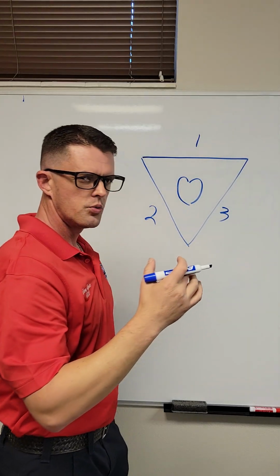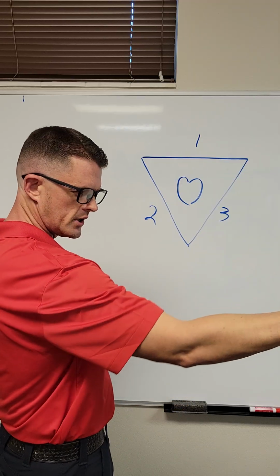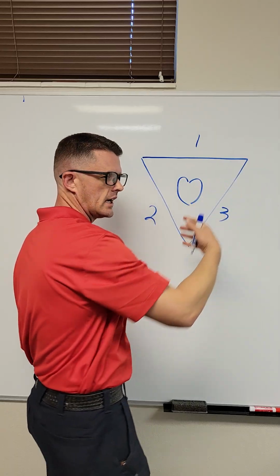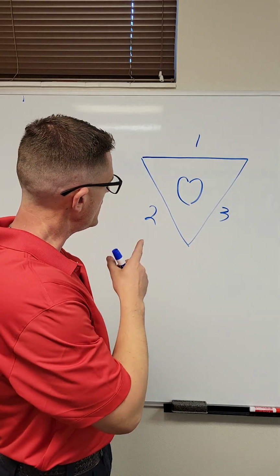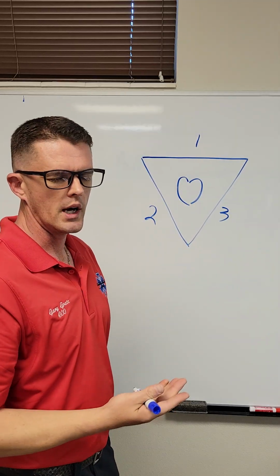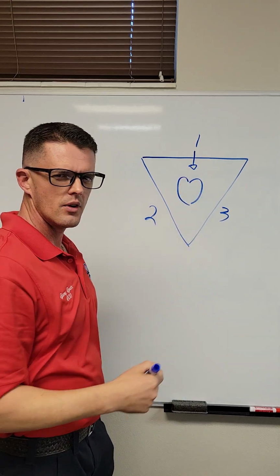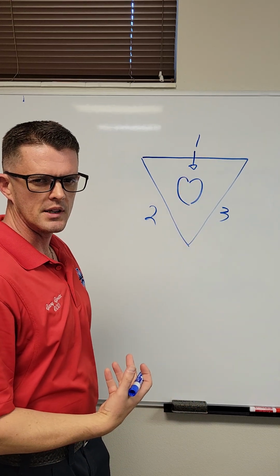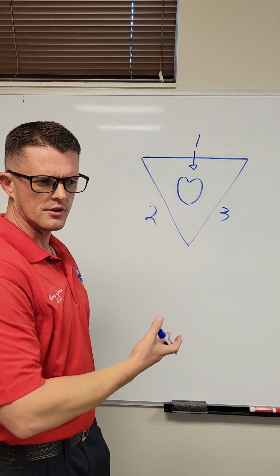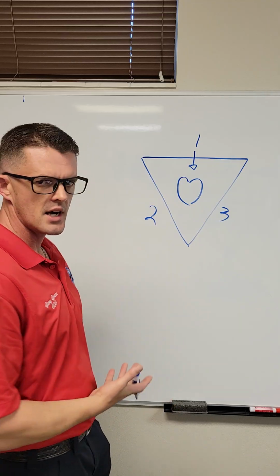One, I know typically is more or less a lateral view. It's usually coming in from the side, right? You've got AVL, 1, V5, V6, and they're looking at it through this lateral view. But a lot of your books will put this diagram up there, and you see 1 on top. And it doesn't make sense. You're like, 1 doesn't look down. It looks in from the side. So why would it be there, right? And 2 and 3, well, those are inferior wall, like 2, 3, AVF, that's inferior wall. Why are they on the sides?